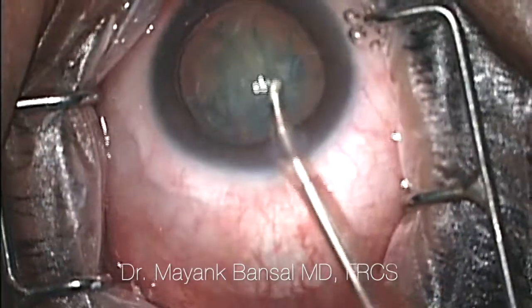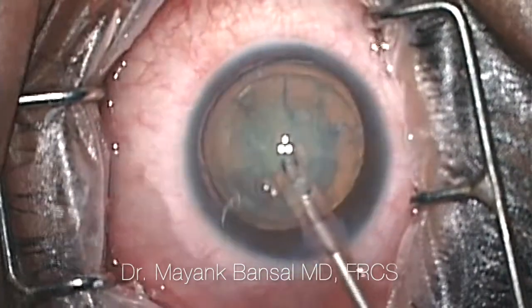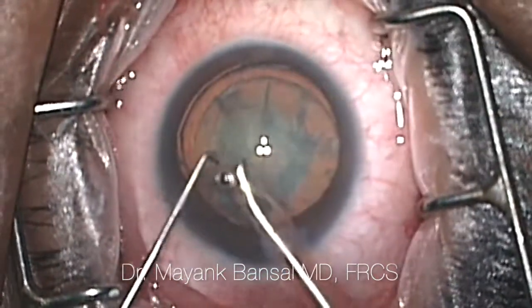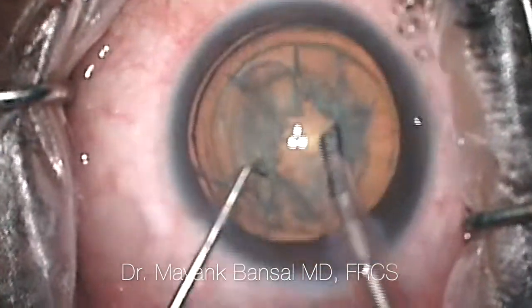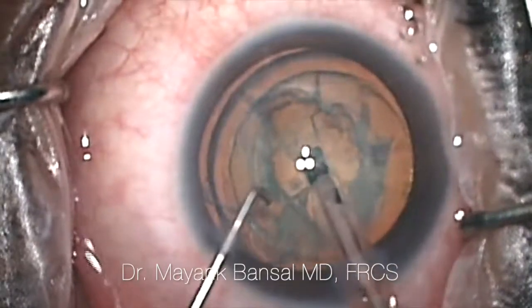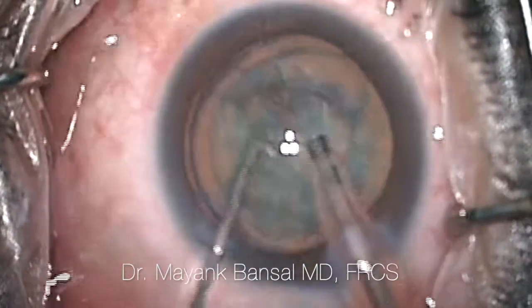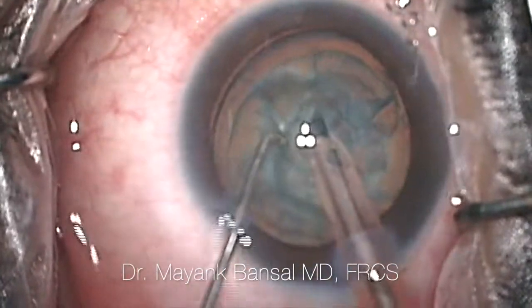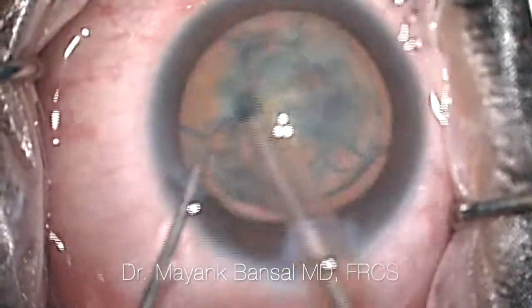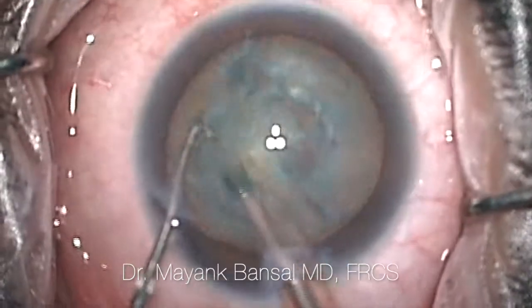Once we've done all of this hydrodissection, we get these nice golden rings and then start off by doing the phacoemulsification. This is the phacoemulsification probe entering the eye. I'm using another side instrument — in this case, it's a Sinskey hook — and we're trying to get these cracks in the lens. These cracks help us in being able to take out all of this hard nuclear matter from inside the eye.